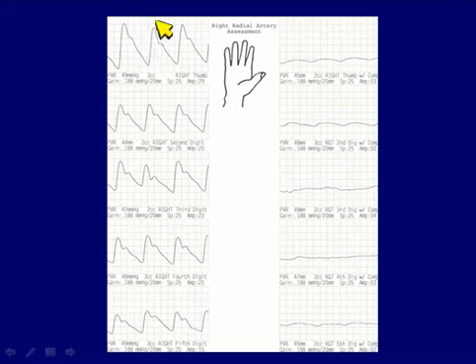We've got, again, a sharp upstroke, a narrow peak, the reflected wave here, no change all the way down, but when we compress that radial artery, we pretty much flatten these waveforms out. So we can safely say that this kind of patient, we don't want to harvest the radial artery to use for coronary bypass, because we probably will get some digital ischemia, and this is a result of the fact that the person is radial dominant and likely has either a small or absent ulnar artery that's not perfusing much, or certainly not perfusing adequately into the hand.